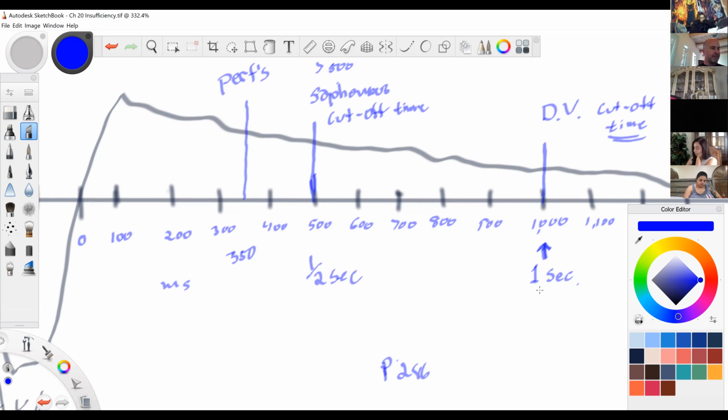Oh, my notes just ended, but I realized we haven't spoken about this. There's this in here that we're talking about: plethysmography, photoplethysmography, air plethysmography. We talk about that.